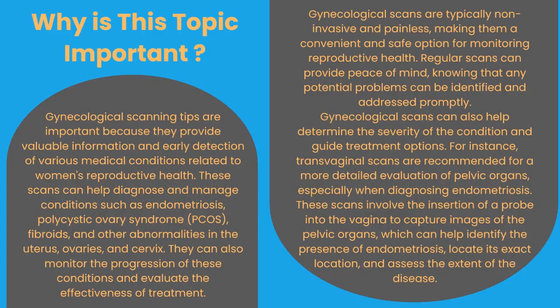Why is this topic important? Gynecological scanning tips are important because they provide valuable information and early detection of various medical conditions related to women's reproductive health. These scans can help diagnose and manage conditions such as endometriosis, polycystic ovary syndrome, fibroids, and other abnormalities in the uterus, ovaries, and cervix. They can also monitor the progression of these conditions and evaluate the effectiveness of treatment.